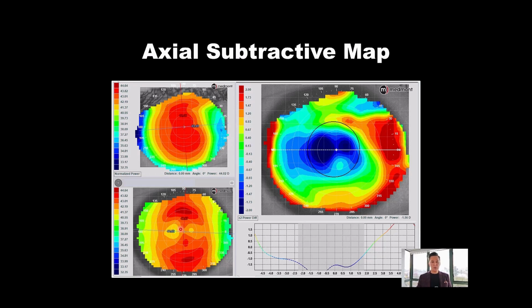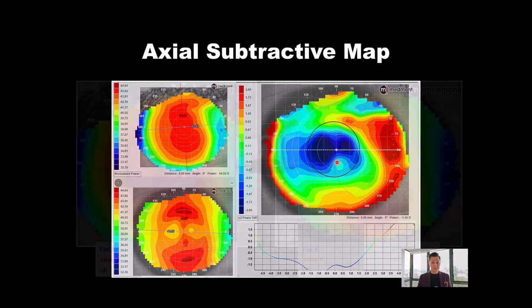Looking at the post-wear map, you notice we're really not sphericalizing the central cornea. Notice these hot areas pushing toward the center. The astigmatism is really still there, and that's what Judy's describing. Our subtractive side shows us a blue treatment zone that's reasonably well centered, maybe a little bit low, but otherwise well centered, but we're not getting a great deal of effect across that steep axis.